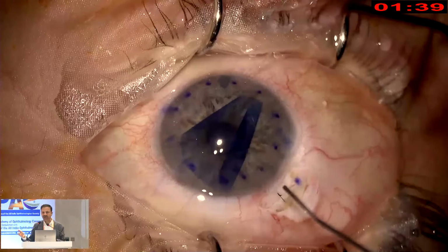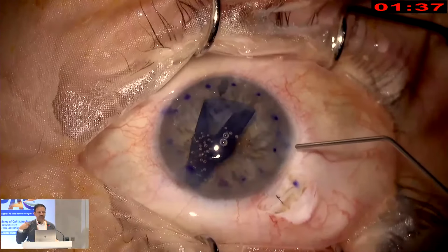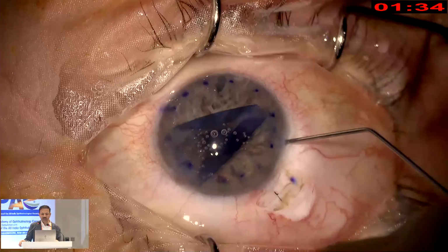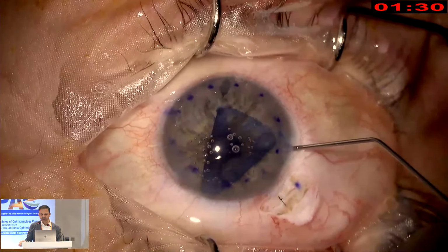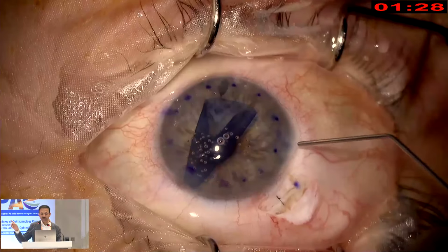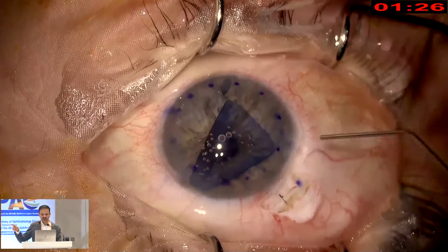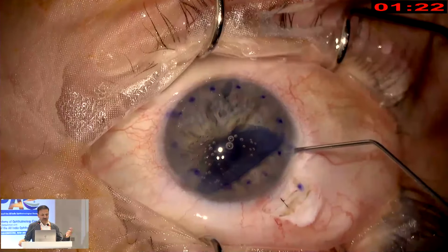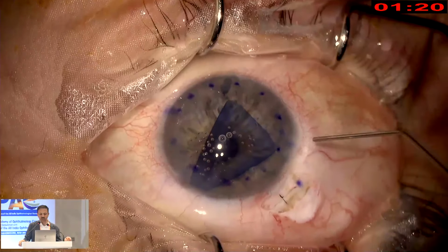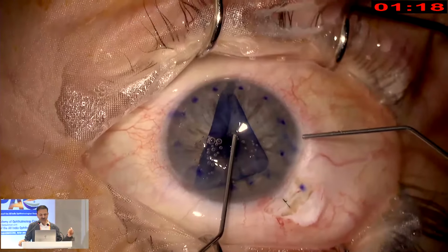Sometimes if you have a deep chamber, as you are inserting with the continuous turbulence of fluid, you can have the scroll getting upside down. Give a short burst of fluid, and you can get the scroll to open up. But remember, if you inject more fluid here, it scrolled, but then as the fluid movement continued, it went back into the upside-down position. So you have to go back and release fluid from the side port.